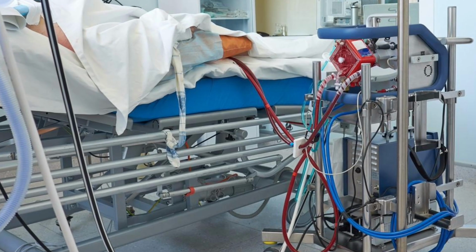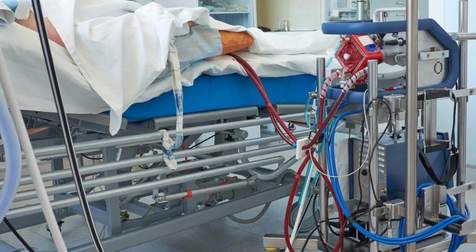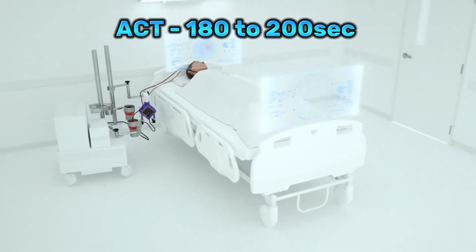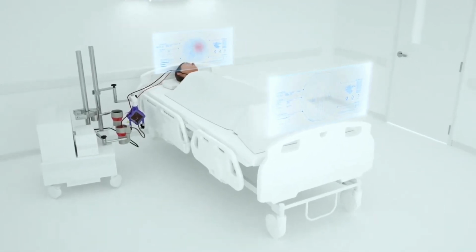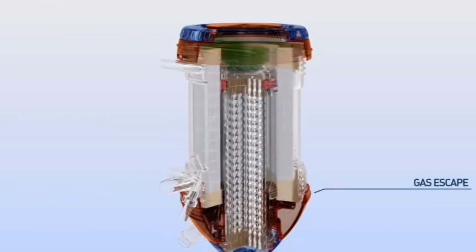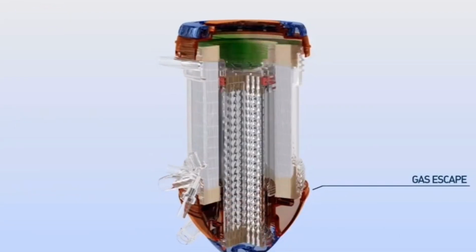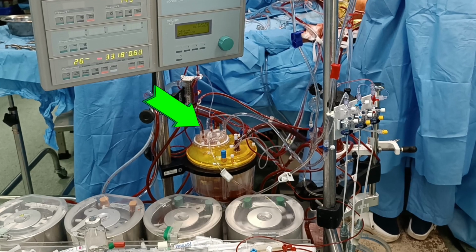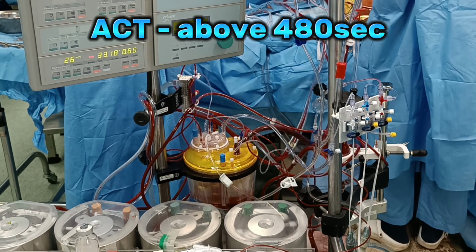In ECMO, reservoirs may not be used. ECMO needs less priming volume and fewer circuit components than CPB, and on ECMO, ACT is maintained around 180 to 200 seconds. Now CPB uses roller pumps and polypropylene membrane oxygenators, which have a shorter duration. It needs more priming volume and circuit components than ECMO. Here a reservoir is used and ACT is maintained above 480 seconds.